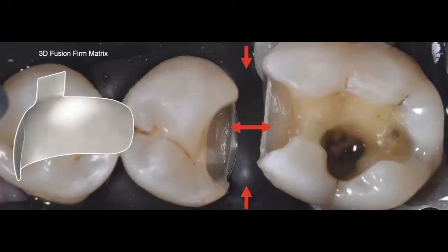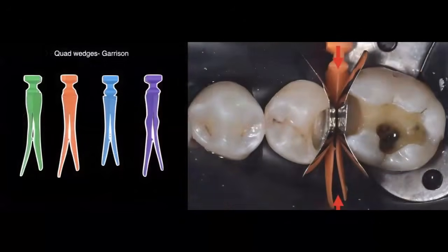I love these bands and I love them for this particular case. And I'm going to share with you a different way that I do this, for a different clinical scenario where I would decide to use maybe the 3D tight fusion band, the color coded ones that have the Teflon inside. So again, this is when I would use these bands for a case like this.